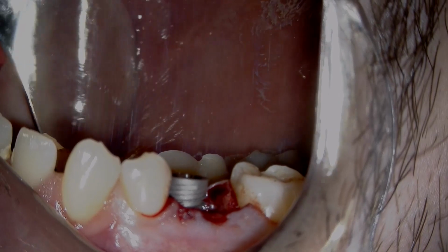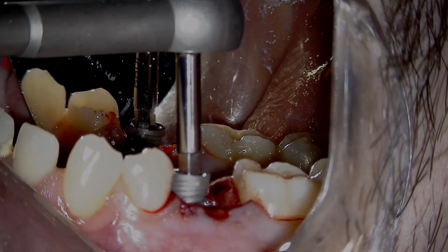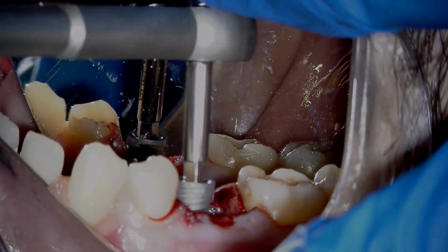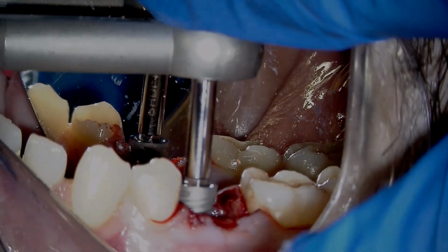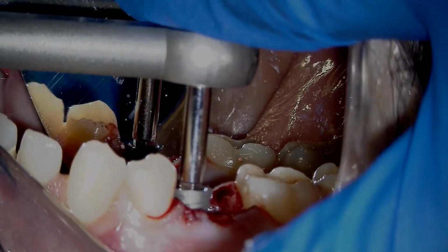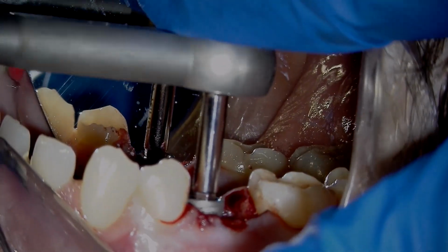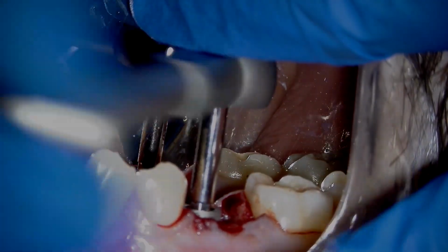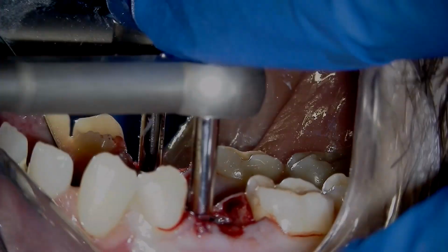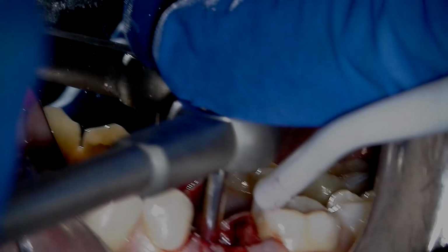Next, I will grab a 2.42 hex driver and place it in the torque wrench and ratchet this thing down to my working depth of 13mm. You can watch that advance. It's going in very nice. There is some pushback from the bone, meaning it is dense bone. You'll see that in the jerking motion of the patient's head.